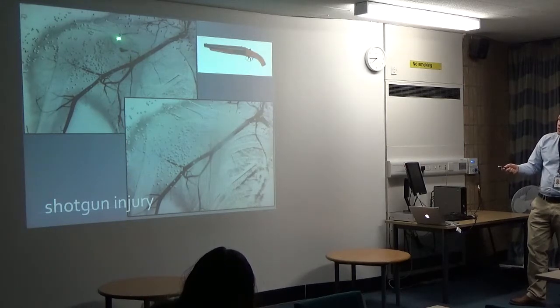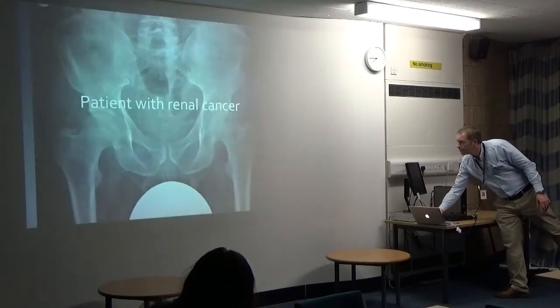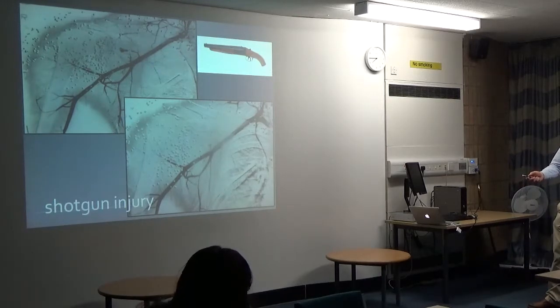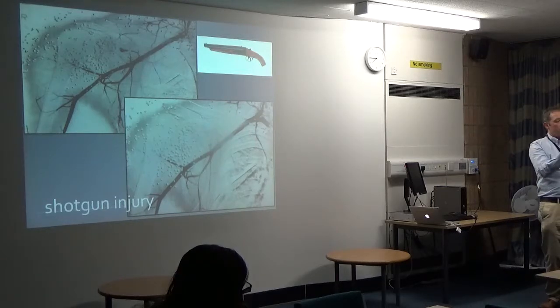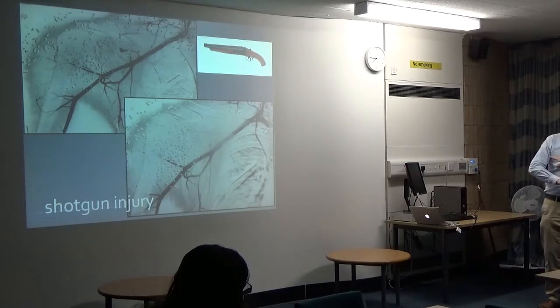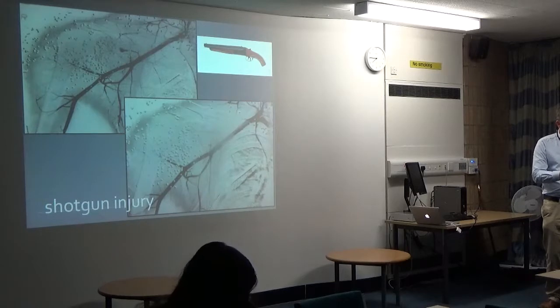So this is just a pellet that's hit a blood vessel and ripped it, so it's actively bleeding. I've just been able to go in with a little catheter and block that off. So when we take the picture again, we can see the splodge is gone, essentially. Has that just been reabsorbed effectively? No. The bleed has just been stopped in the second picture. There'll still be a huge bruise there, but that'll go down over months. All you see on these sort of pictures are what's happening in those few seconds.